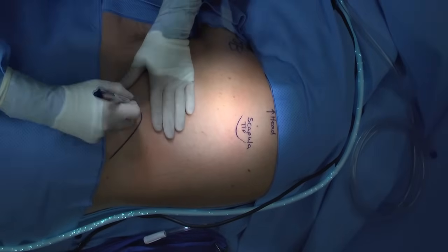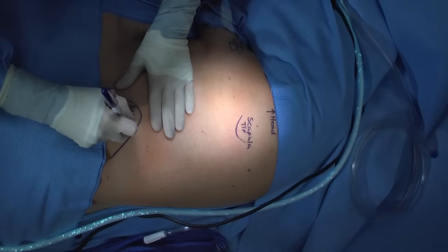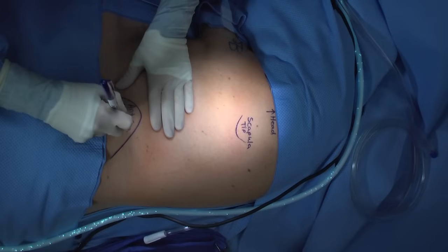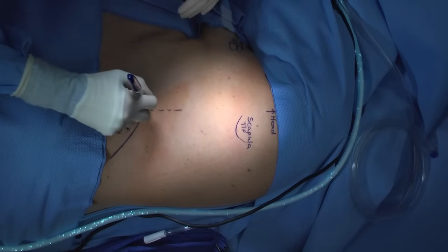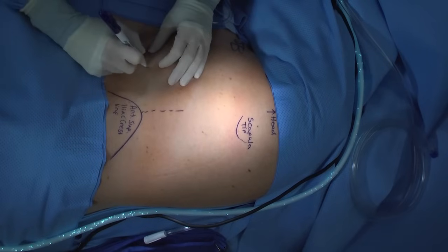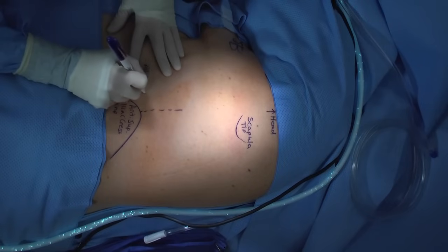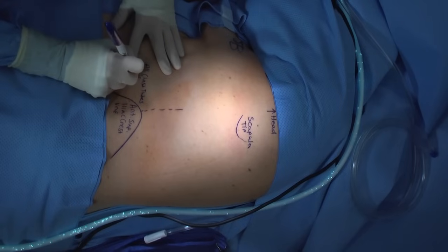We start by identifying the tip of the scapula. This can be accomplished by pushing down on the shoulder to gently move the scapula against your finger — mark that spot. Next, feel for the anterior superior iliac spine. Between these two points will help you identify your mid-axillary line. It is ideal to place chest tubes in front of this line for patient comfort, so that they're not laying on the chest tube.